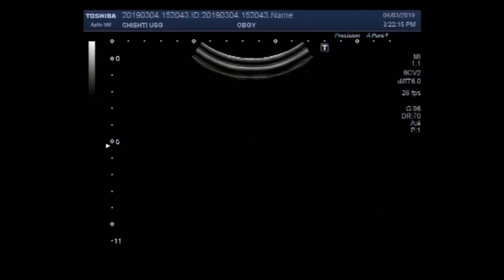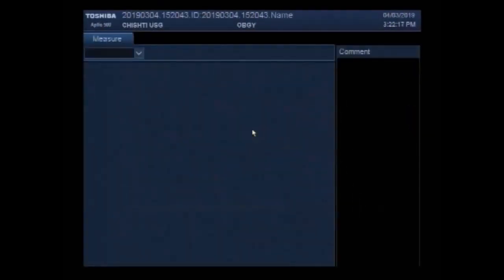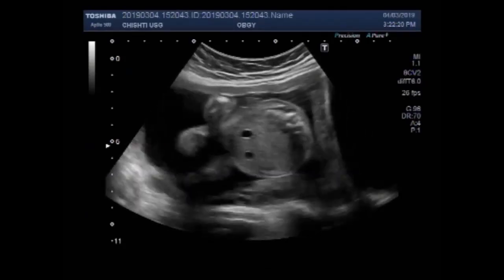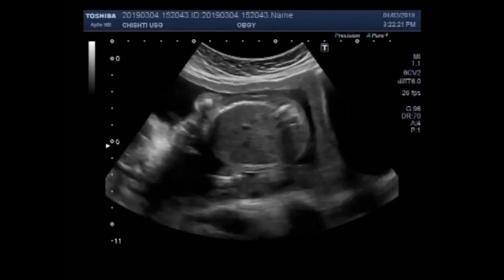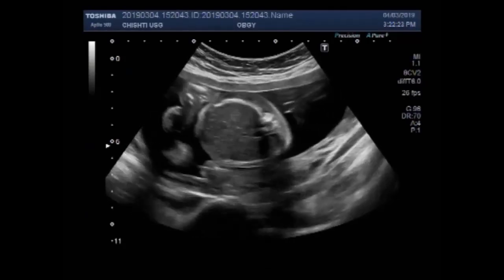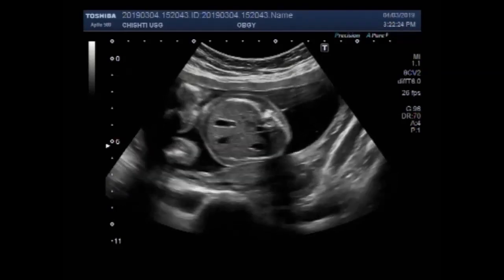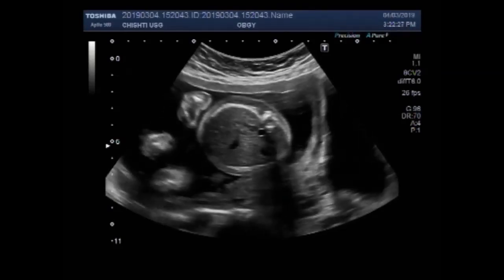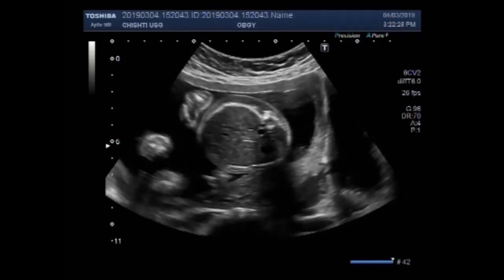Dear viewers, I hope you are all fine. This ultrasound video shows a congenital talipes equinovarus, often also known as clubfoot, along with fetal soft tissue edema.